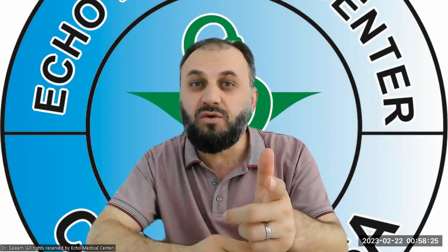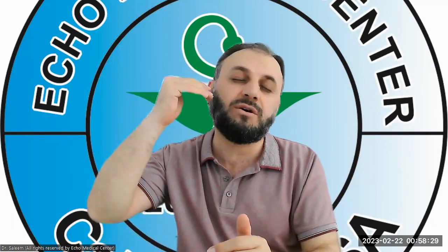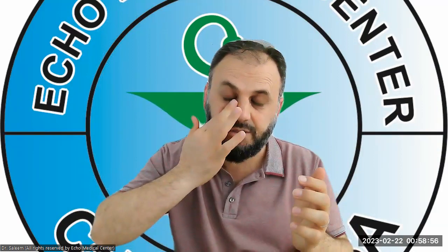And try your best for the distal portion of the ICA. Go all the way to see where you can see the vessel entering the brain, and that's really deeper. So you go higher by the mandibular bone, and go all the way, and you will be able to find it. Those are all sagittal images, ECA and ICA, and then CCA and bulbous are both transverse and sagittal.